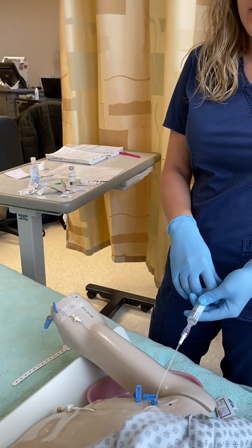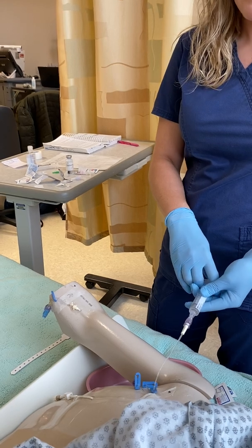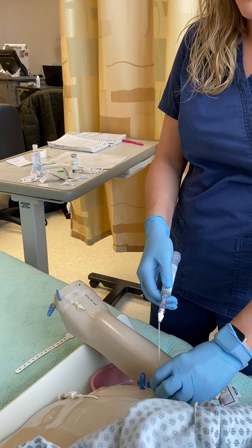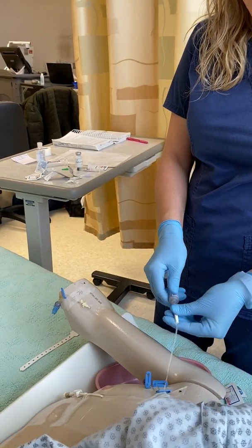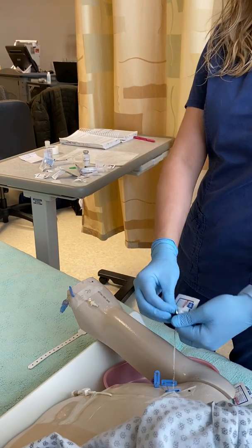So if it was a PICC line, you would want to make sure you're doing the pulse technique. And we're going to say that we gave this over the 2 to 3 minutes. Go ahead and clamp. Clean for the last time.